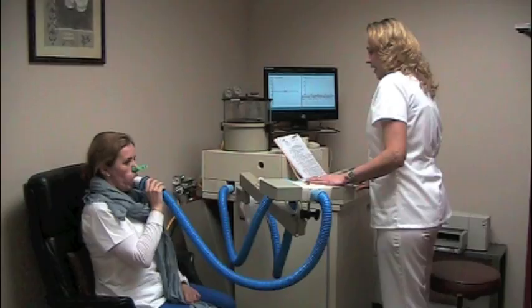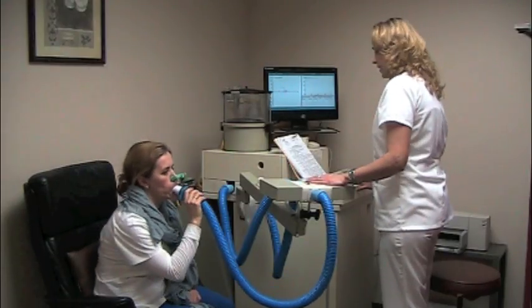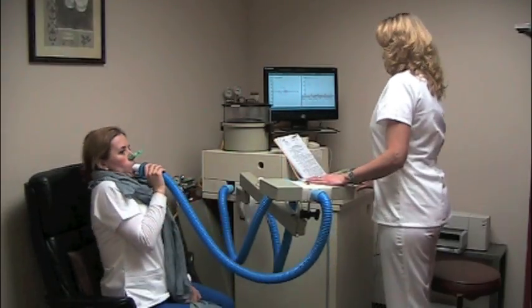Prepare to take a deep breath in and blow it out. Keep blowing. Take a deep breath in. Good. Thank you.